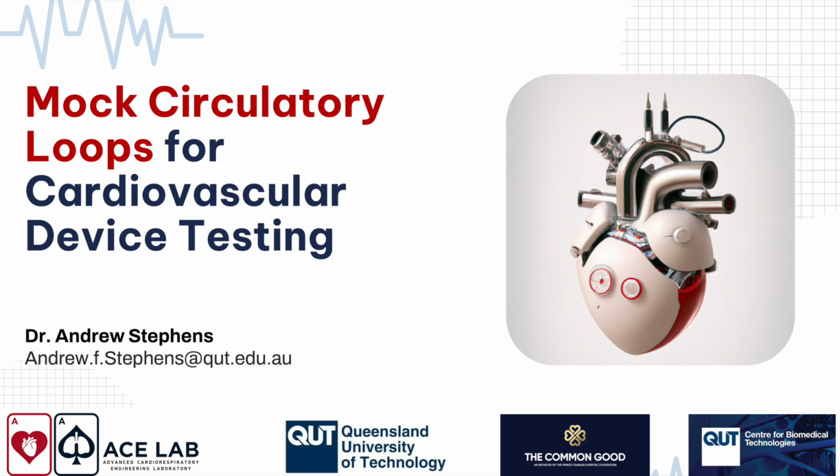When you're in a fight or flight mode, for instance, your body will constrict blood flow to your extremities in order to redirect that blood flow to your heart and brain. So there are a number of survival mechanisms that cause that resistance to change, and we can simulate that.